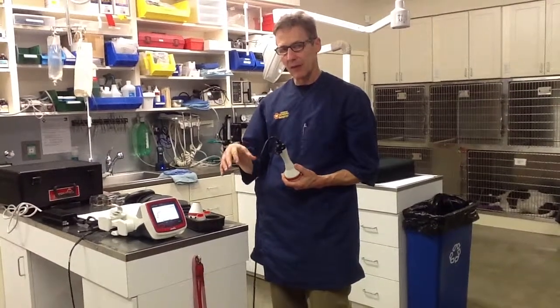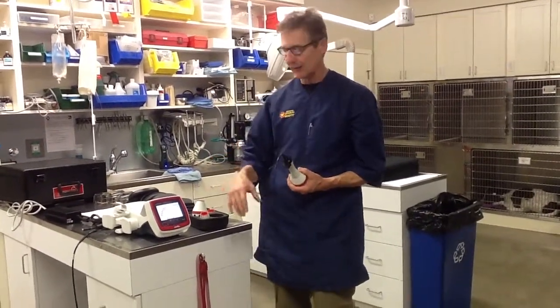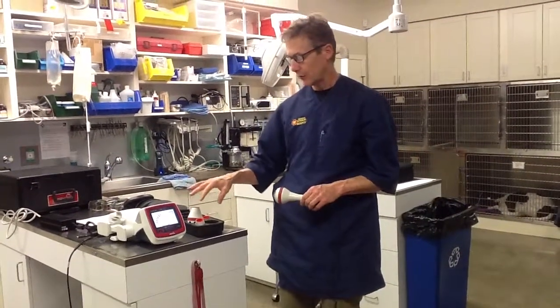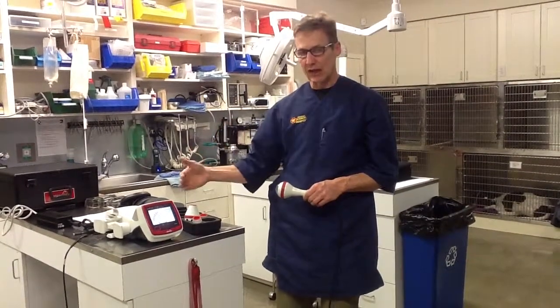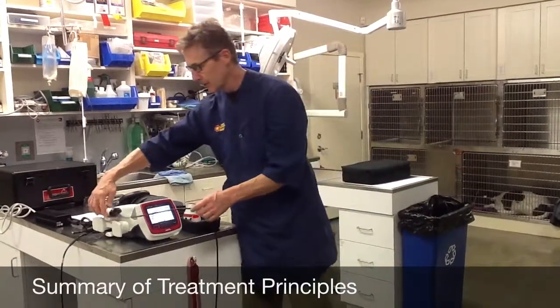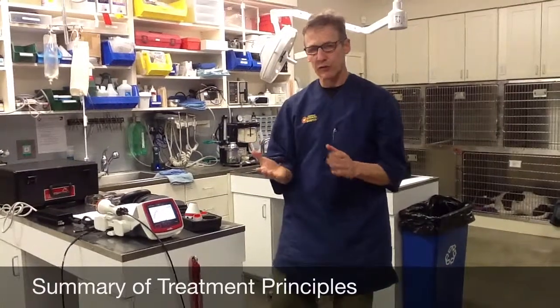It is important to have that done consistently in that pattern, at that speed, at that distance, and to follow the protocols and dosing that the laser gives you in most instances, unless the doctor wants to change the suggested dosages. I think that covers our general treatment principles.